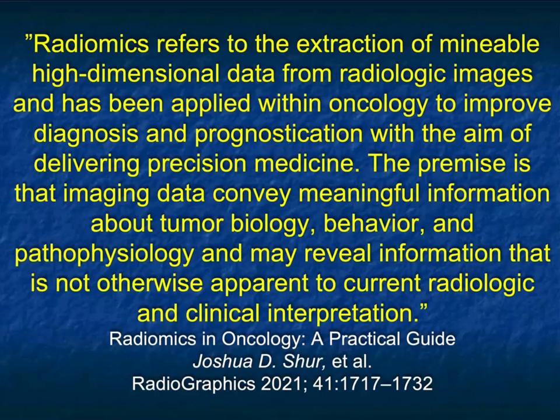Now, the way you think about radiomics, maybe this in an easy way. When I look at a CT scan, I look at all the information I could see on the scan. I change windows, I zoom up, I look around, I do all sorts of reconstructions. Radiomics really then takes things to a new level. It's extracting information from images that you really can't see within the images.